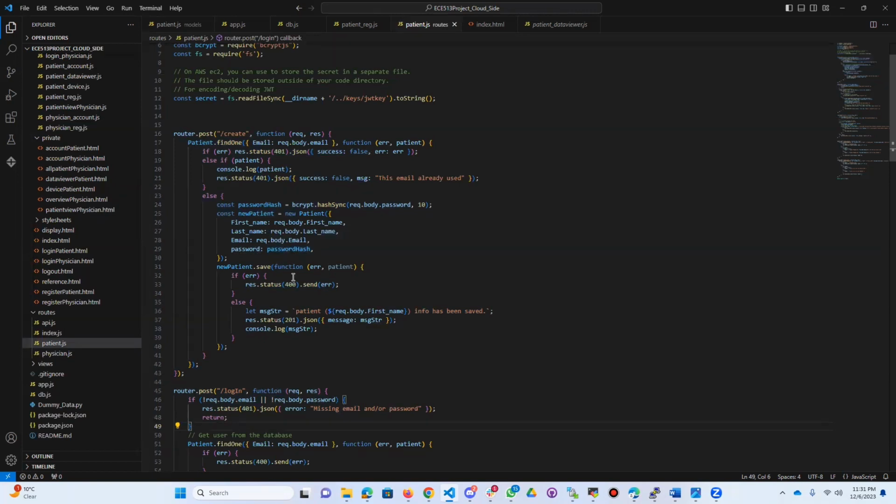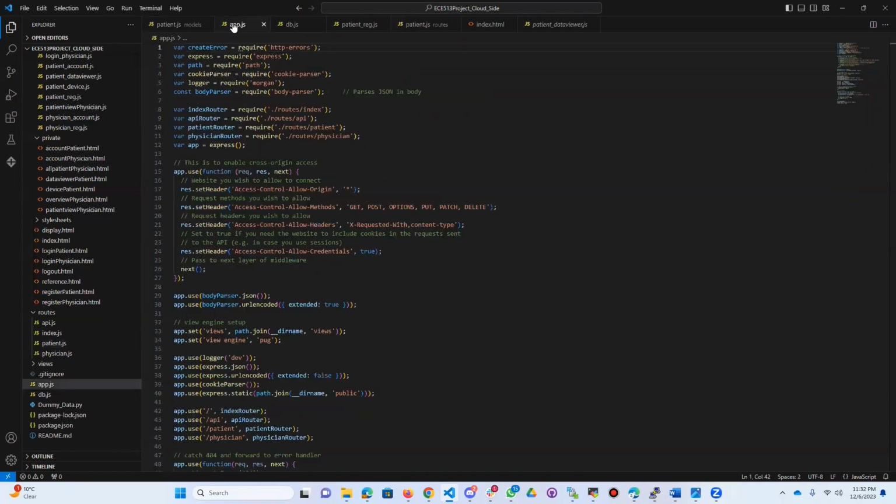The schema also sets the default values for some fields, such as the physician's name and the device details. The code then creates a patient model based on the schema, making it easy to interact with patient data in the database. And then if we come to app.js here, we can see this part is for cross-origin access.